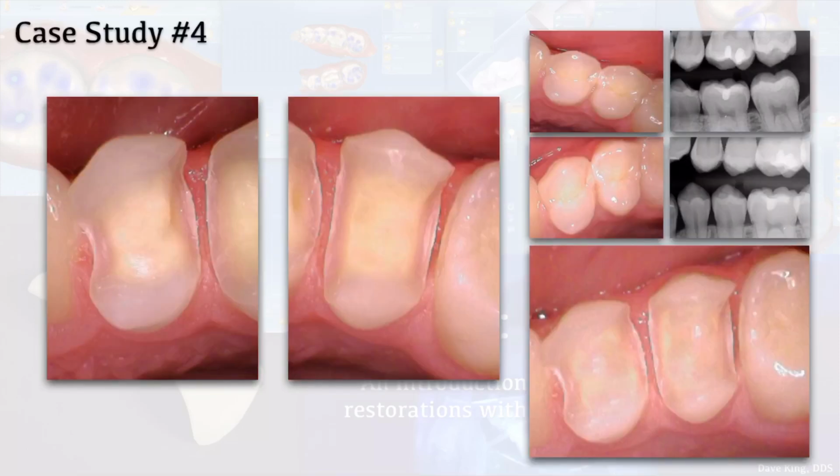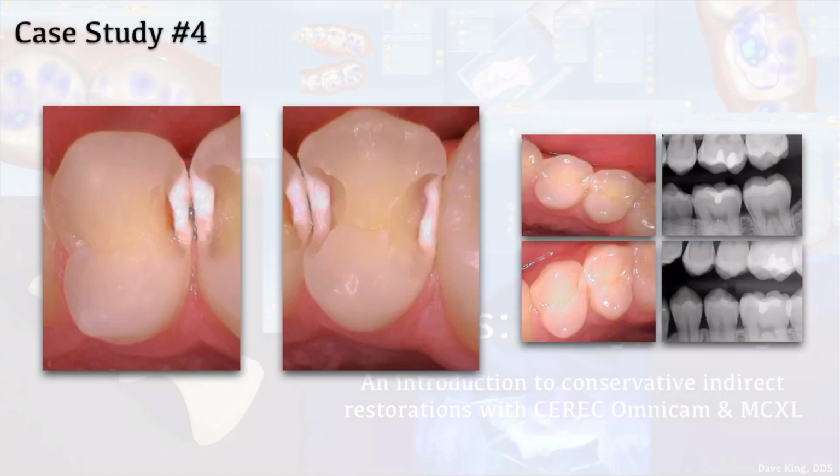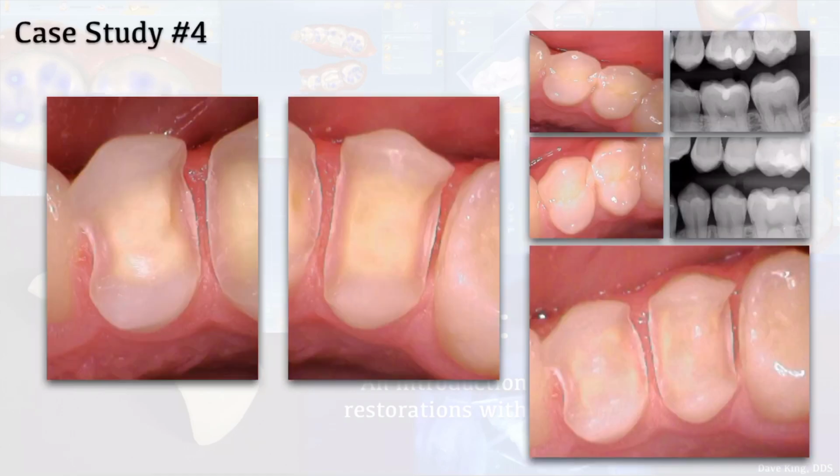So here's the preps. Now these are pretty big preps. I didn't originally think I'd have to extend that far, but the mesial and buccal and lingual spread of that interproximal caries was phenomenal. So by the time I got it out, it was open way out, and then I ended up coming through kind of in that fashion to cover everything. So a little less conservative than I originally wanted to be, but to get all the decalcification out of these areas, it took a lot more opening than originally I had wanted to do.